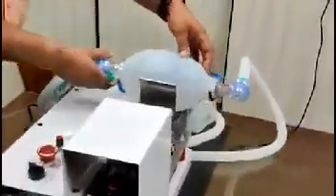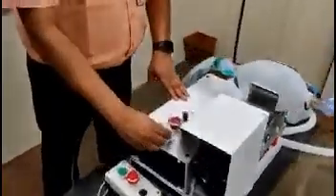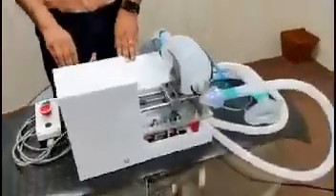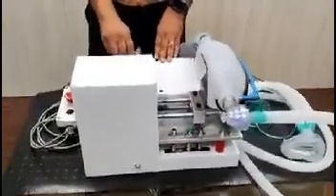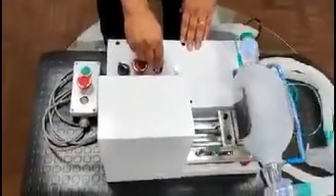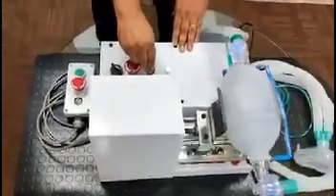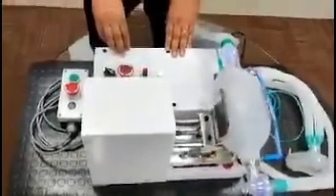Let me explain the key features of this device. The rate of air pumping can be controlled with the help of the speed control switch provided. There is a potentiometer which controls the RPM of the motor. As we rotate the knob, you can see the speed is getting increased, and we can achieve zero to 30 breaths per minute.